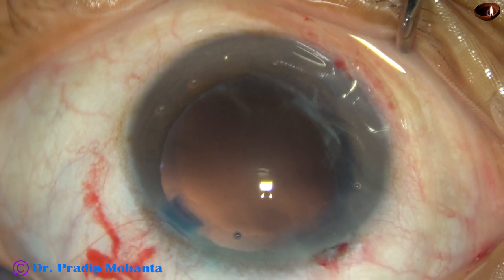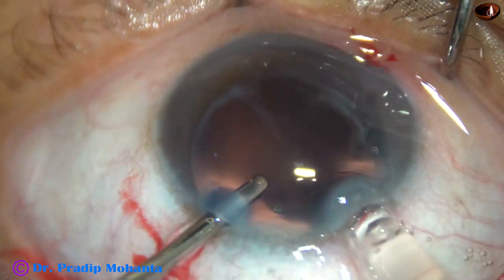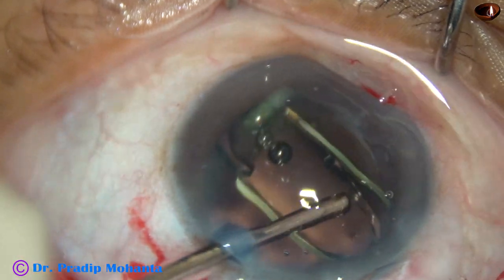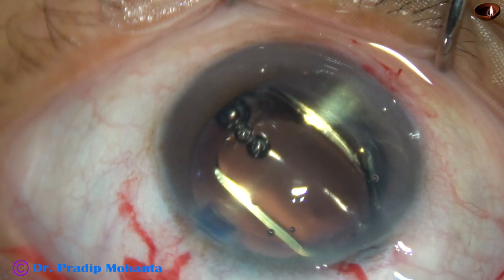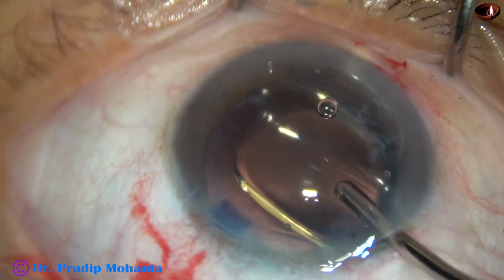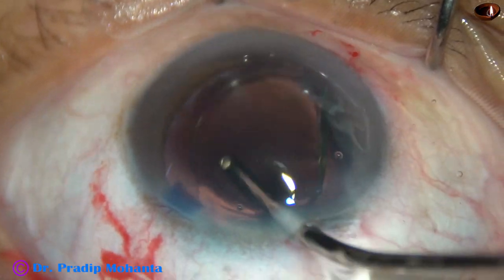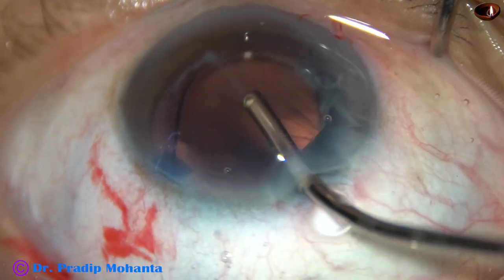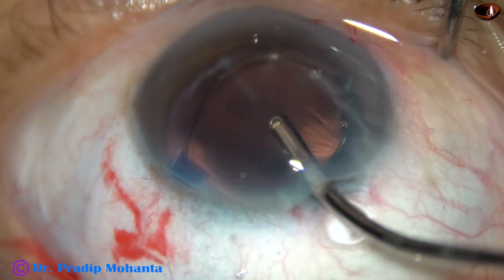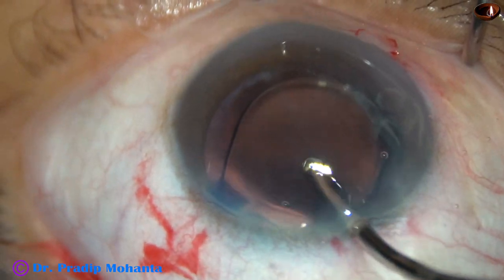It is now time to implant an intraocular lens in the capsular bag. After enlarging the main wound slightly, a hydrophobic acrylic single-piece monofocal intraocular lens is implanted in the capsular bag. The IOL is dialed using the irrigating probe itself, which has the advantage of expelling any viscoelastic retained in the lumen of the cartridge.